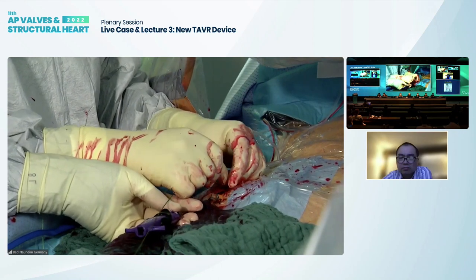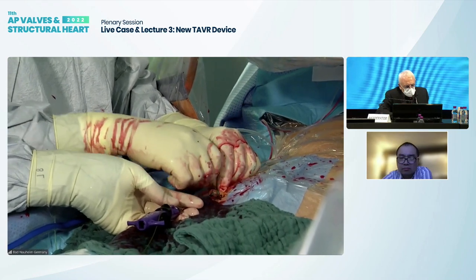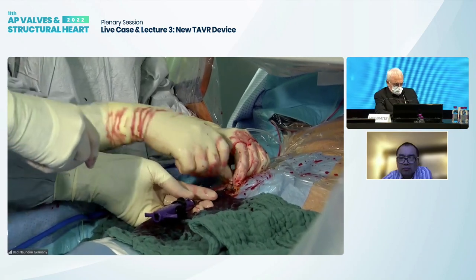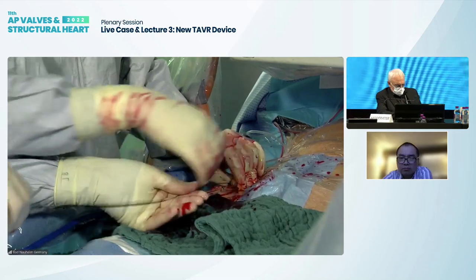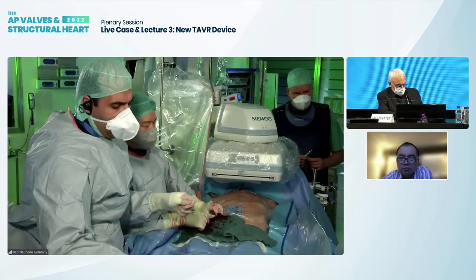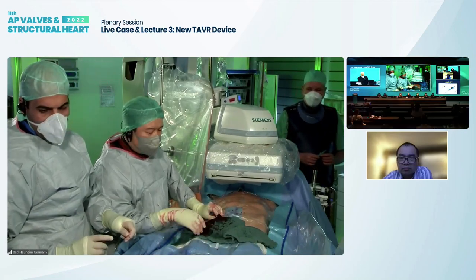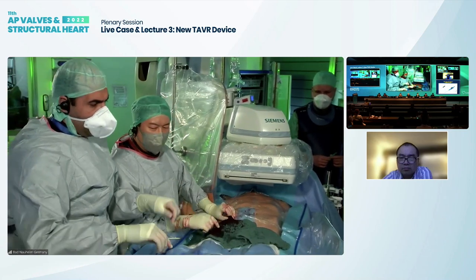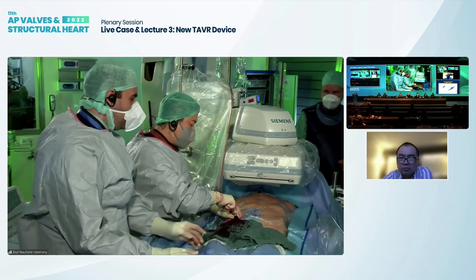This is our experience. Yeah, in case you have oozing or blood, you compress or you're using AngioSeal, right? Exactly. Yeah. And this is actually very frequently the case, that we have oozing or residual bleeding. And then I think also the combination between one ProGlide and one AngioSeal is very effective and might also increase the safety. We have not analyzed it yet, but it was a gut feeling.